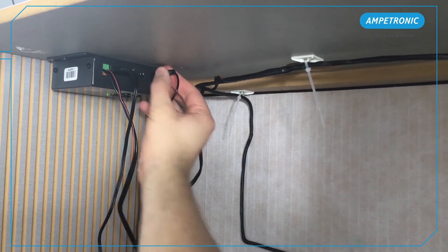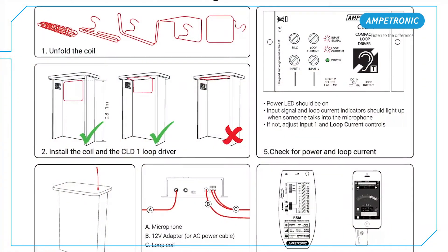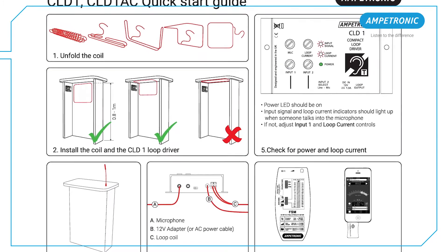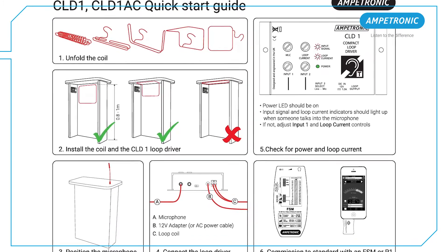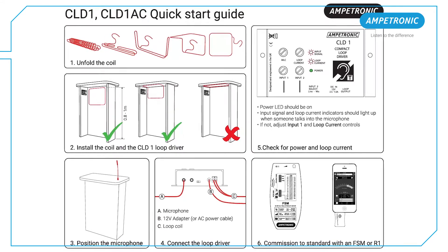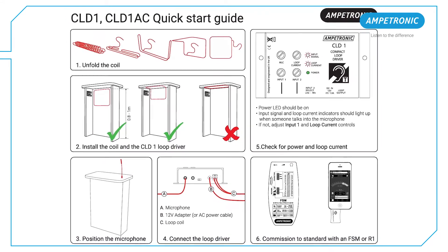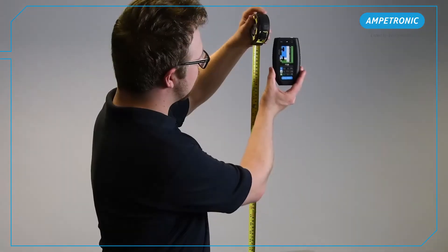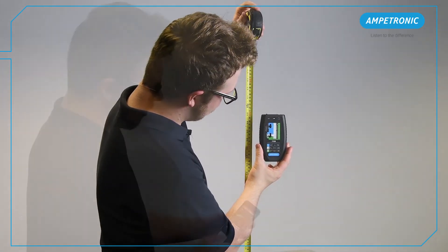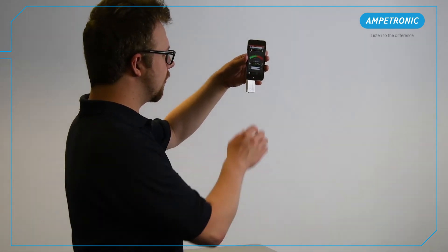This is the installation finished. The CLD1 comes preset with input and output levels in a suitable position to work with the supplied microphones and loop coil. However, it should be fully commissioned to make sure the installation is meeting the relevant performance standards. We have separate videos showing how to do this with either an Ampetronic field strength meter or a Loopworks Measure app with R1 receiver.